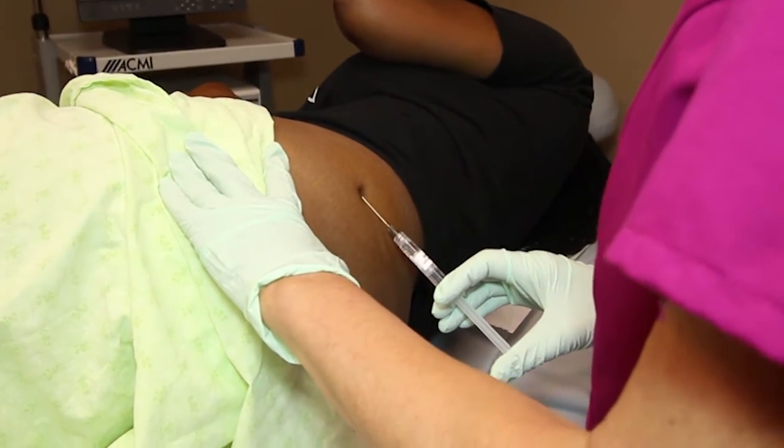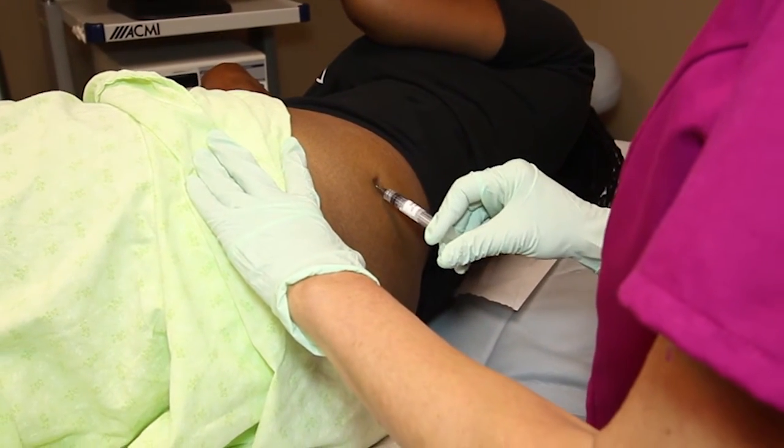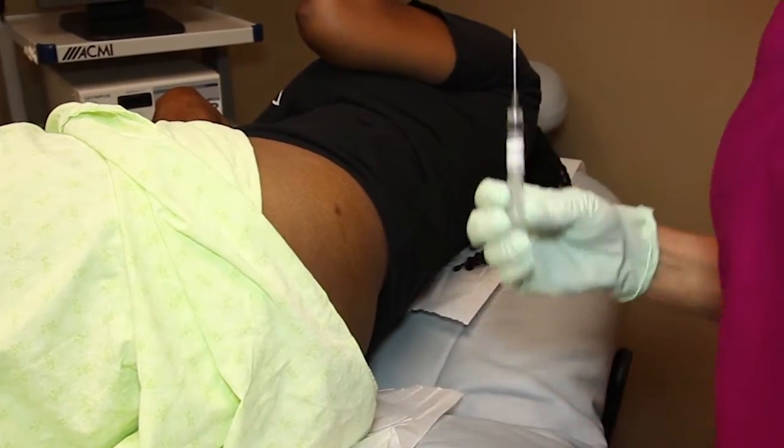Then we're going to inject some lidocaine with epinephrine. This is buffered lidocaine with epinephrine, so it doesn't hurt as much as regular lidocaine.